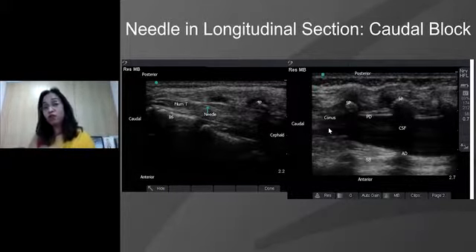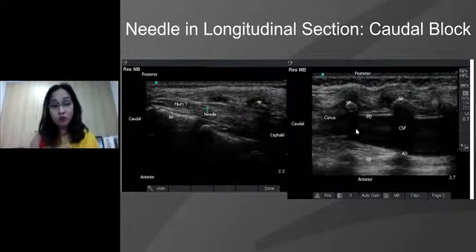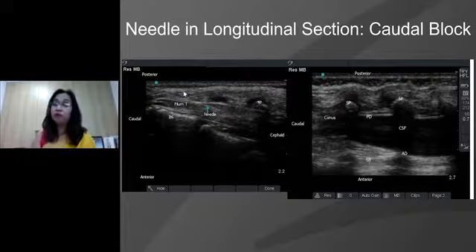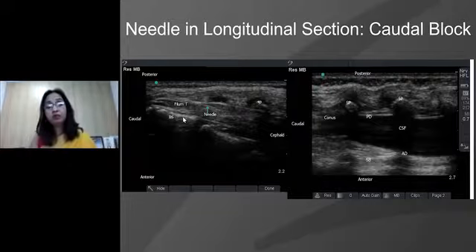We have a good chance of withdrawing the needle and not putting it where it should not be going at all. So we cannot be subcutaneous, because if we were to be subcutaneous, we would see the needle right here. We could not be even beyond the base of the sacrum. Another complication staring at us would be injury to the sacrum and sacral osteomyelitis.